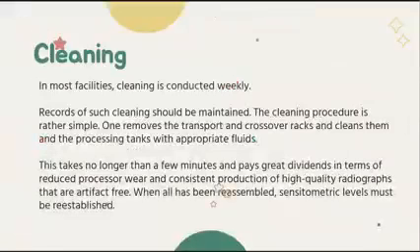Now we go with the cleaning. So how do we clean an automatic processor? In most facilities, cleaning is conducted weekly. So records of such cleaning should be maintained. The cleaning procedure is rather simple. One removes the transport and crossover racks and cleans them, and the processing tanks with appropriate fluid.